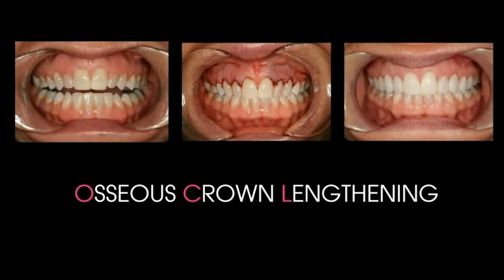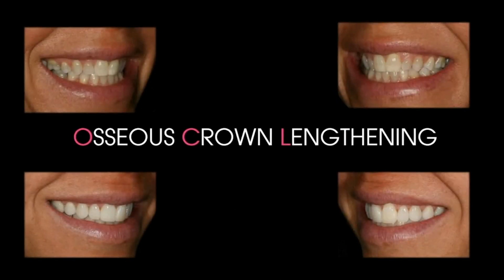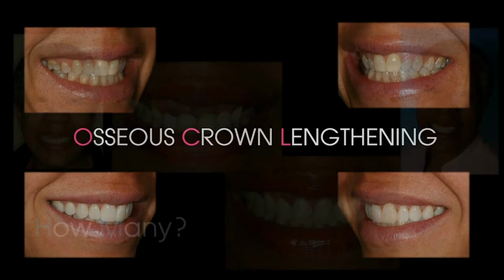Here's a case of osseous crown lengthening where the laterals are smaller, and by being able to balance someone out, I get a much nicer temp result and a much nicer finish just by doing a little osseous crown lengthening. In this case, she didn't like her small laterals, and she thought her centrals were too big, which they weren't. It was simply the proportions of the laterals. So we did some prepless veneers on her with some osseous crown lengthening.